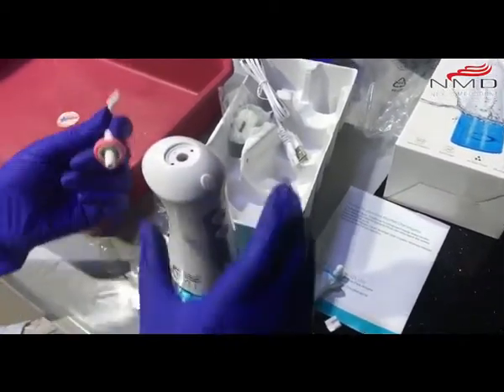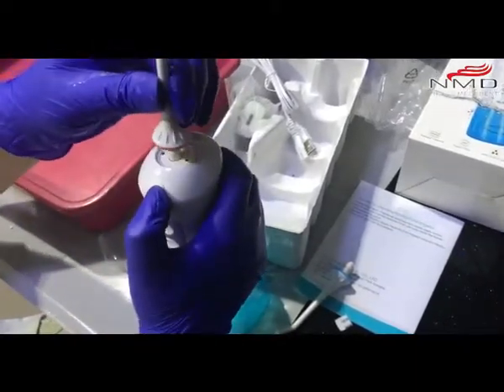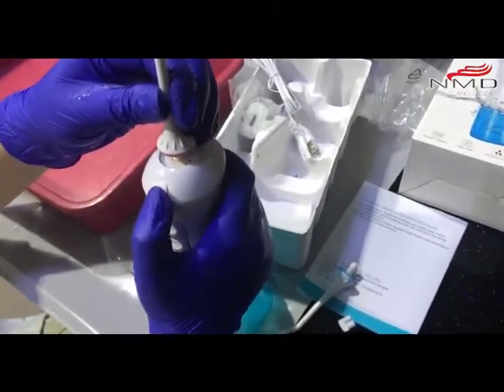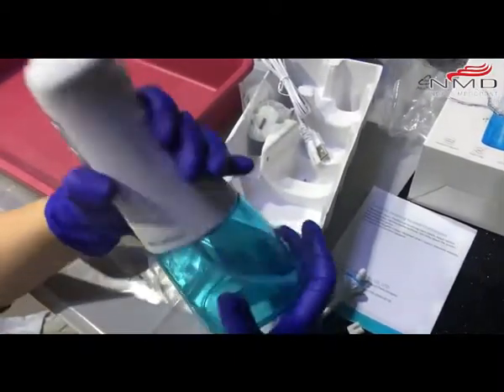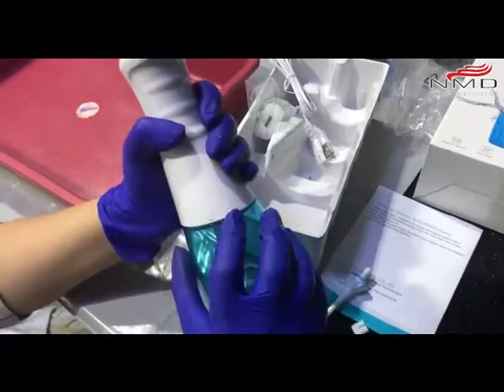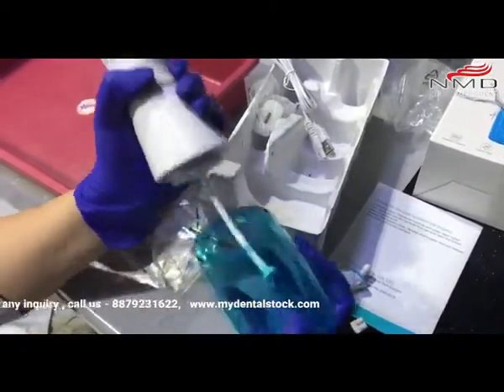Let me show you this. You have to press this button and it goes like this. You have to rotate this — this is lock and this is unlock. Rotate goes like this.